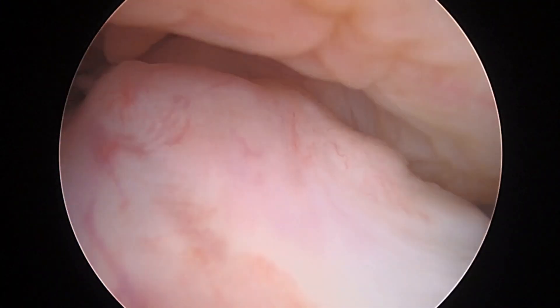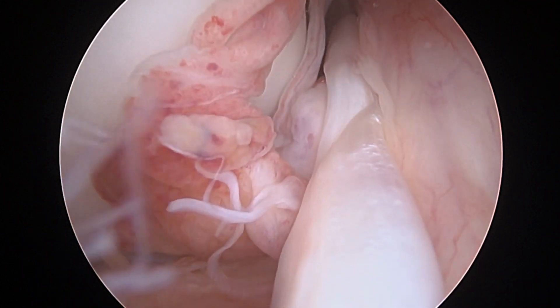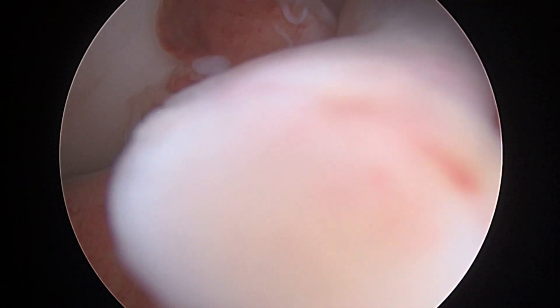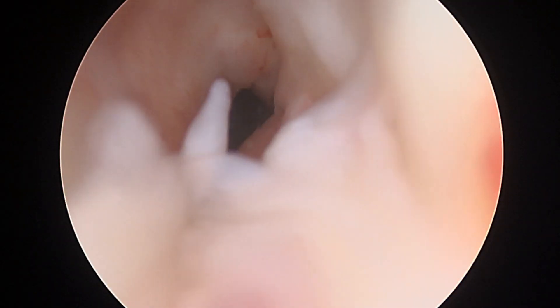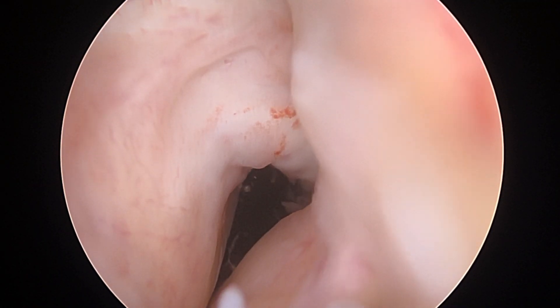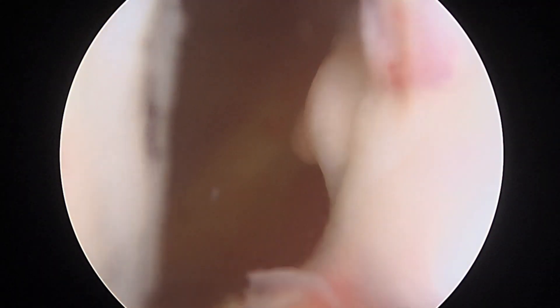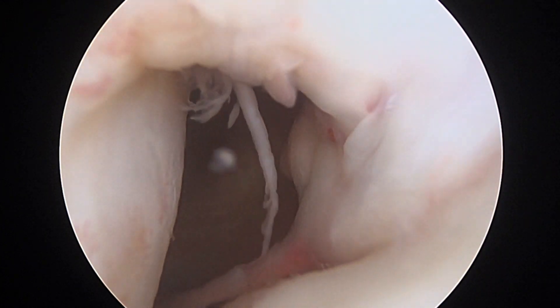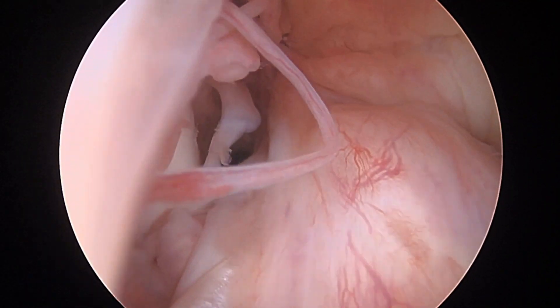Very good. Surface good. Check in full flexion. And then there's our notch area where our ACL tear is. There's some fiber tearing over there laying down. There's a fiber that's torn at us. The ligament ought to be running all the way back here. We shouldn't be able to go all the way through to the back of your knee right there. So it's consistent with what we know.